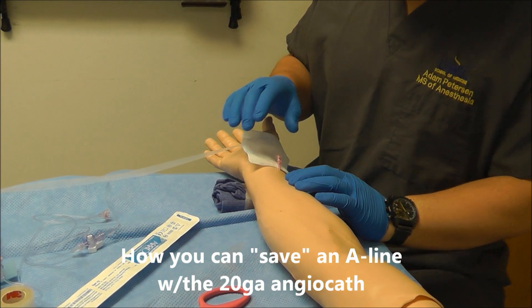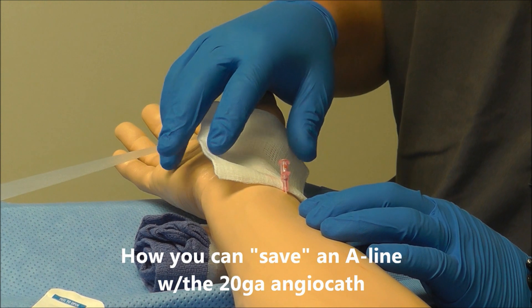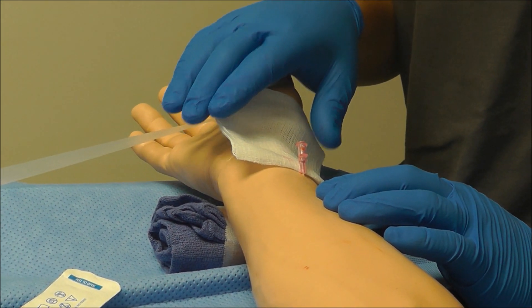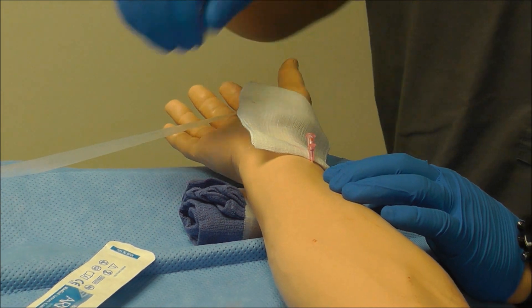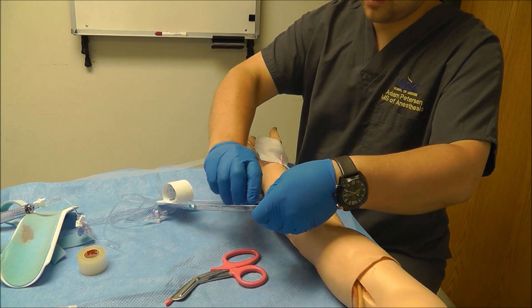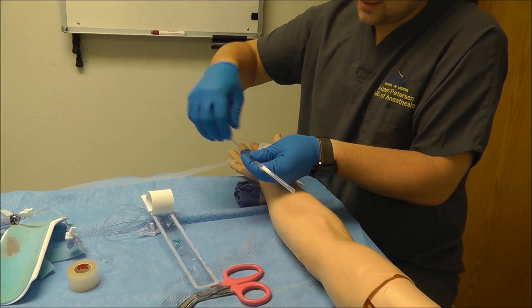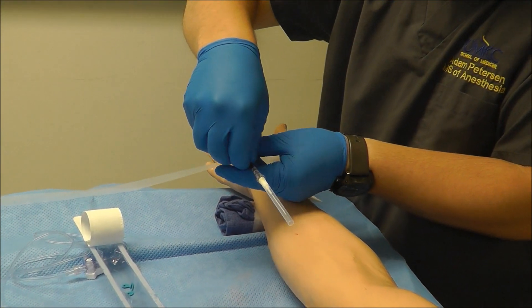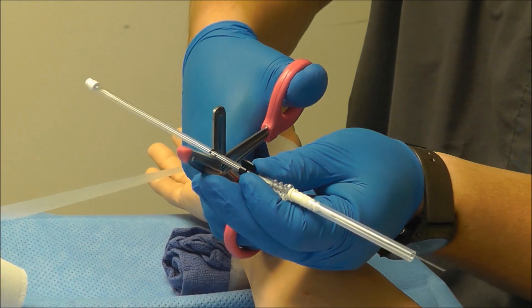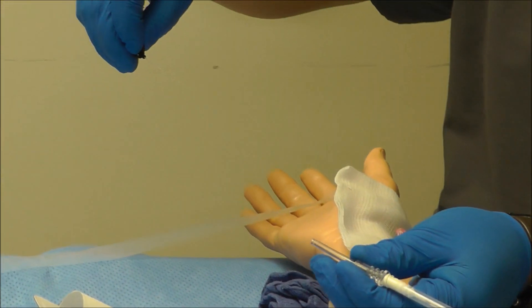If I accidentally pass the angiocath all the way through both lumens of the artery, we can still save this, but you will need a wire to do so. If you do not have a wire readily available, you can use one from an arrow kit. All you need to do is grab an arrow kit as well as a pair of scissors. Advance the wire through the needle, then cutting through the plastic sheath and not the wire, cut the plastic portion off and pull the wire out.